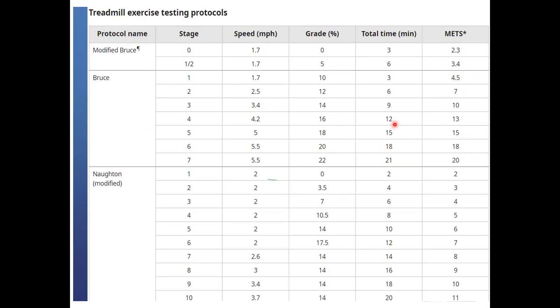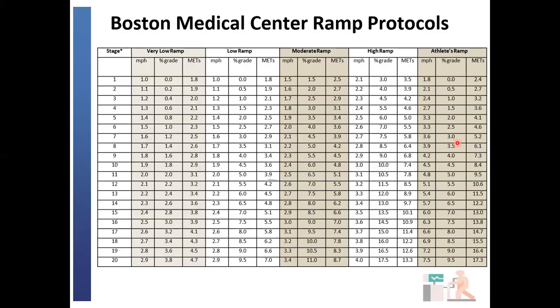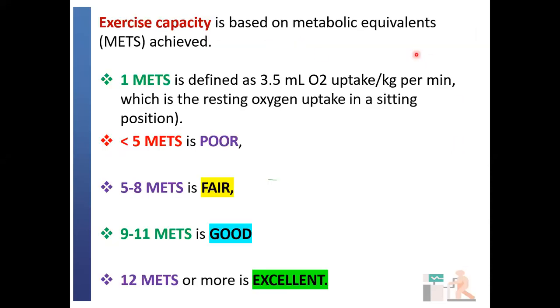But this is placed here for us to be able to look at it, and note the speed of various stages in the Bruce protocol and their corresponding METs. This is the Boston Medical Center ramp protocol also. I don't think this is necessary for any memorization.